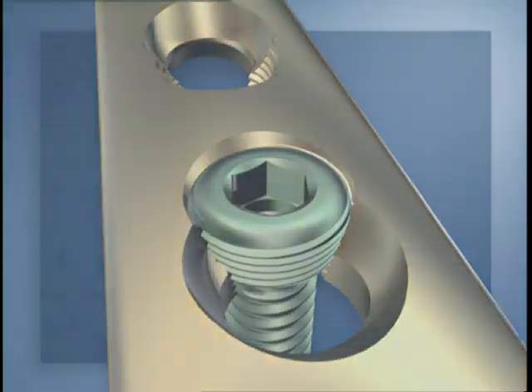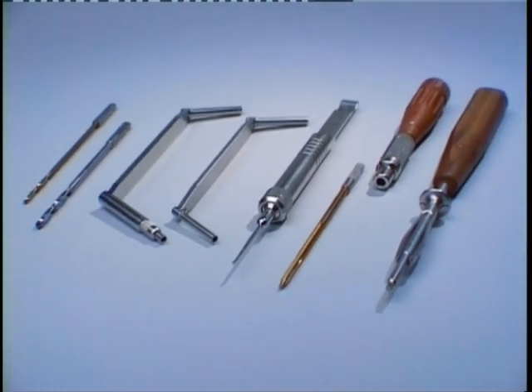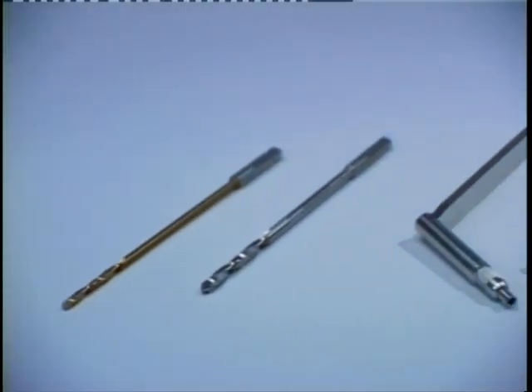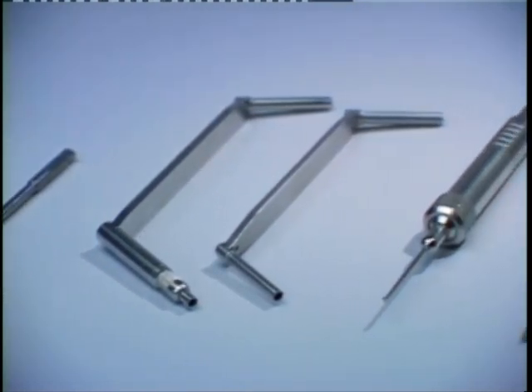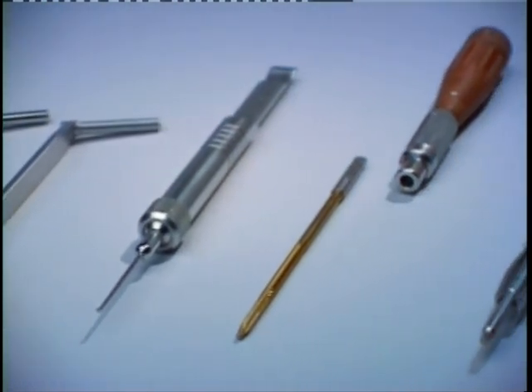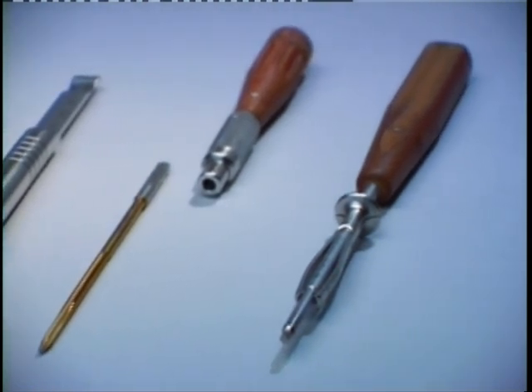To apply the LCP to the radius in the conventional way, the following instruments are used: the 2.5 and 3.5 mm drill bits, the 3.5 universal drill guide, the 3.5/2.5 double drill guide, the depth gauge, the 3.5 mm tap and handle, and the small hexagonal screwdriver with holding sleeve.